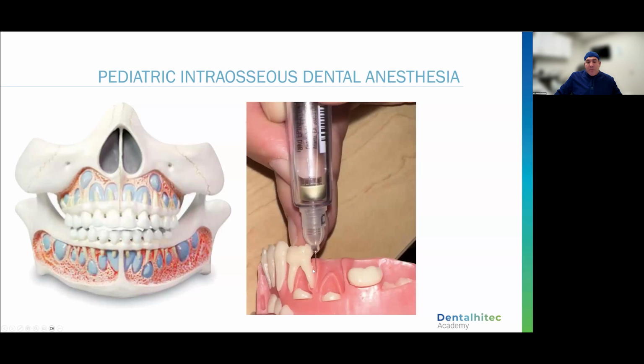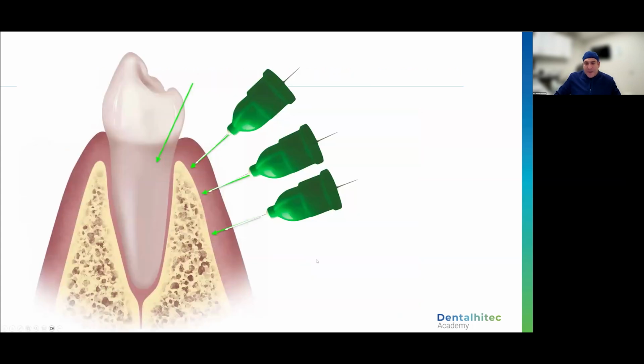If you wind up touching a developing tooth bud with one of these, we need to have a little talk about dental anatomy. Unless the tooth is ectopic in the wrong position, you are miles away from a developing tooth bud. I am not worried about any issues with either the needle touching or pressure on that developing tooth. You are very far away, right?